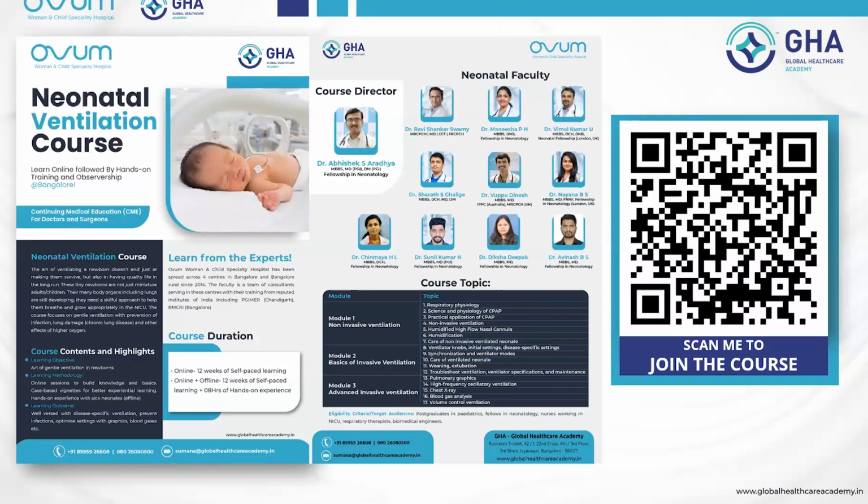Most of the questions we have covered. There are some of the DM students who have joined here, as well as some researchers. So do you think in the next 5 years, what will be the research gaps or prominent questions for us to answer in the area of bubble CPAP? I think one of the important gaps is delivery room CPAP, humidification in the delivery room, and also starting CPAP with intact cord resuscitation, intact cord CPAP, where you start CPAP and then you cut the cord. So these are some important things which can be shared.